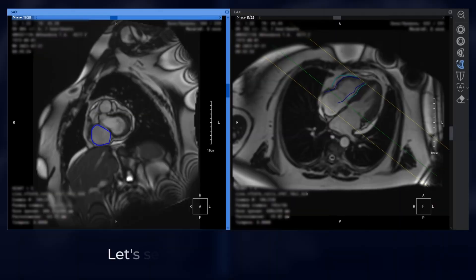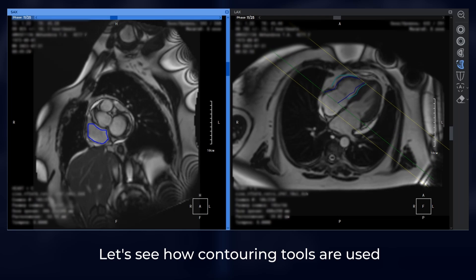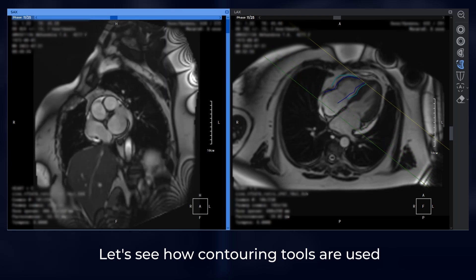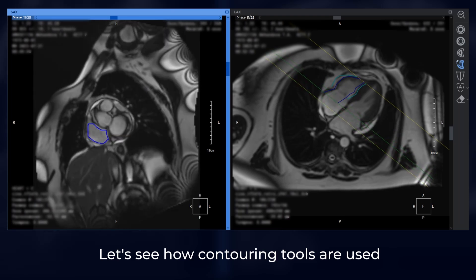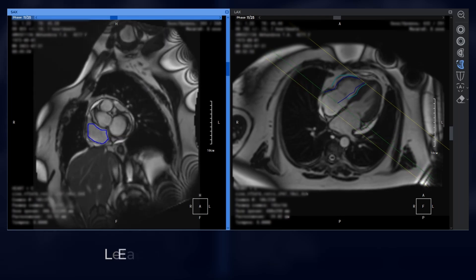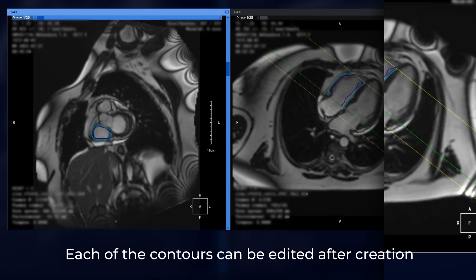Let's see how the contouring tools are used. Each of the contours can be edited after creation.